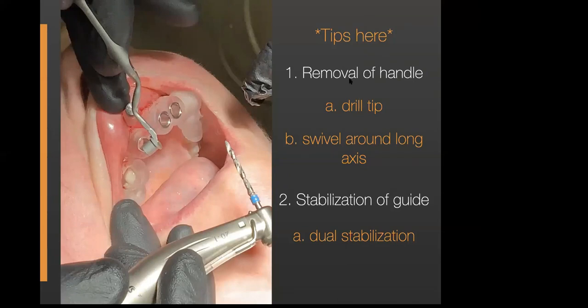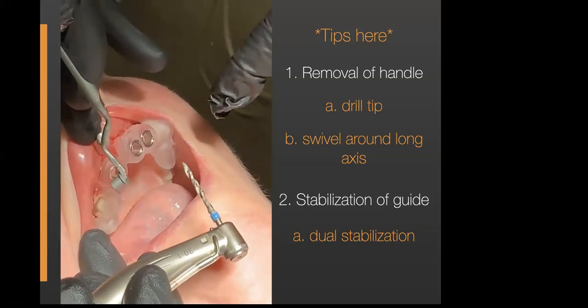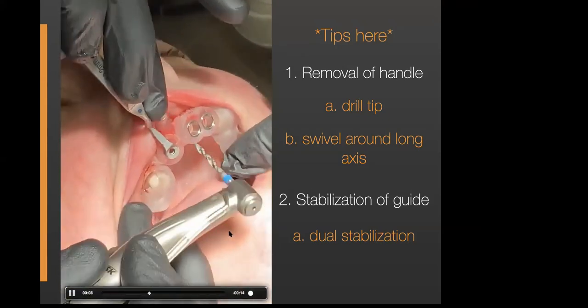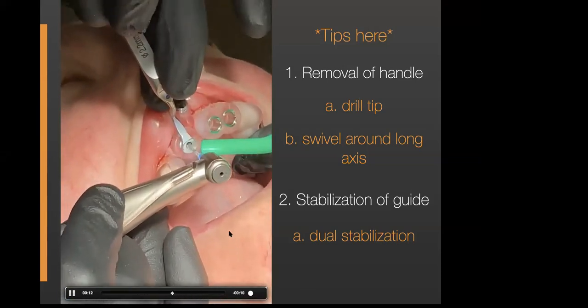So there's a couple tips here, and I just put these in this morning, okay? Because I want to make sure that I tell you. I want you to watch, I'm going to play this twice. It's very short. Just watch the video. Don't worry about the text on the right. It'll make more sense in a second. So I'm drilling.